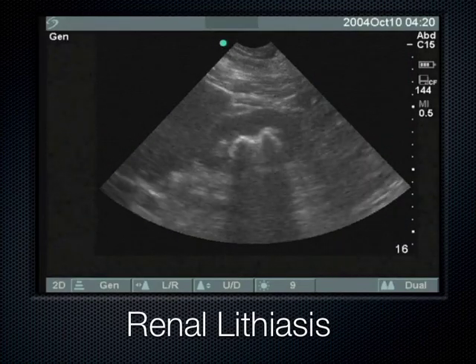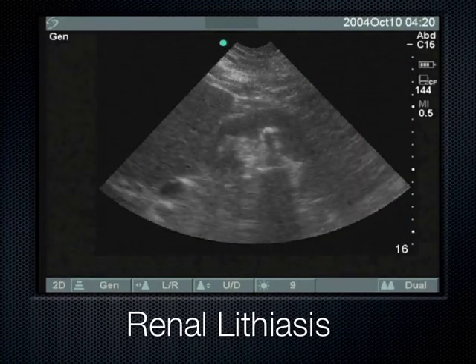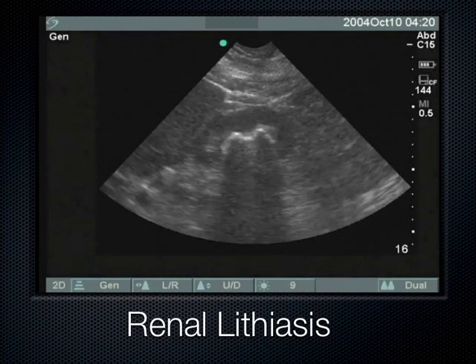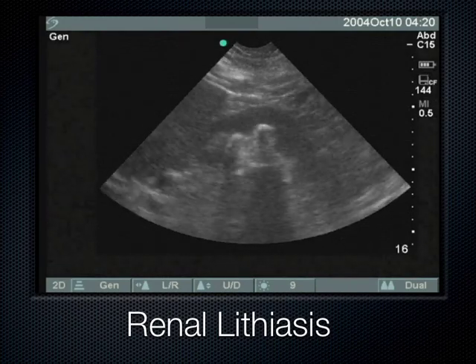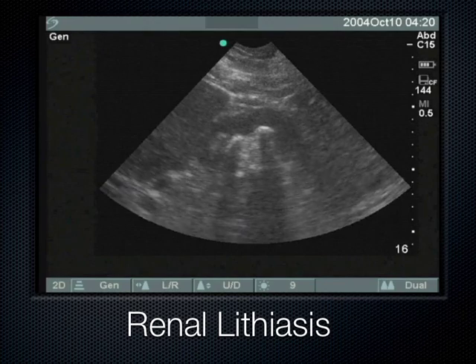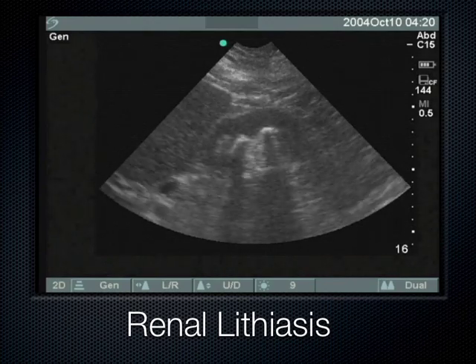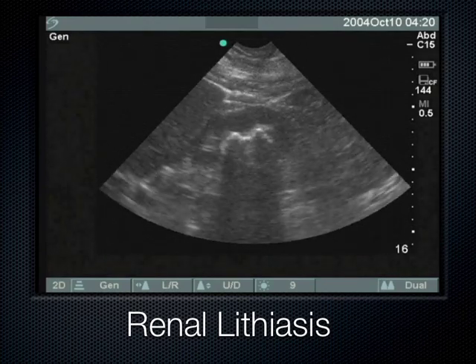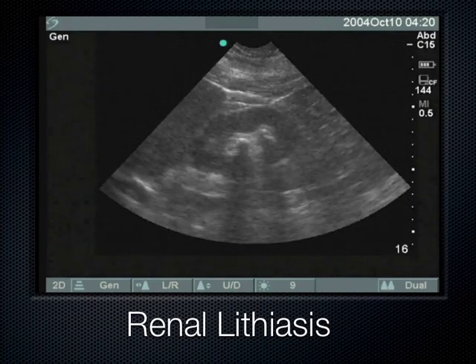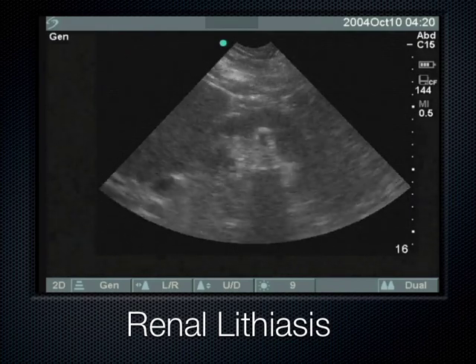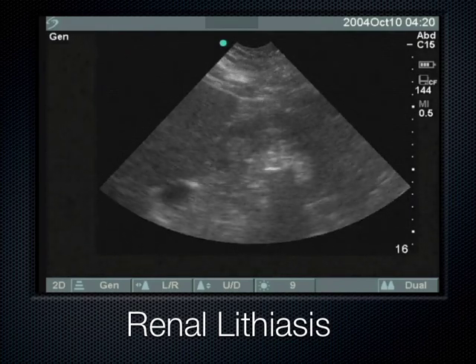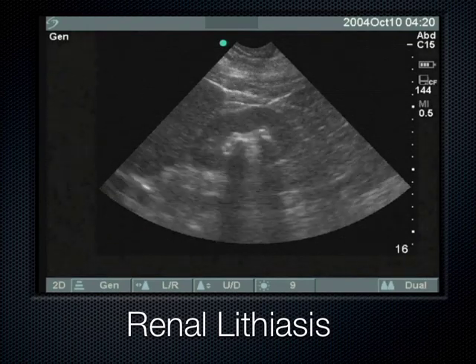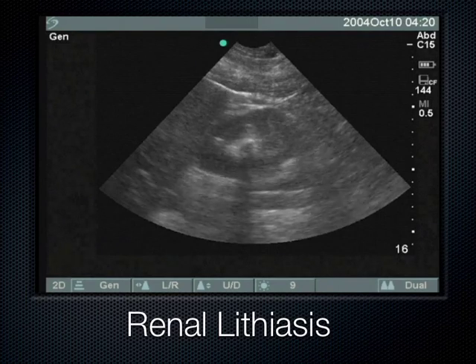When there's a stone — or in this case a couple of stones in the kidney — we know they're stones because they cast a shadow all the way to the bottom of the screen. Sometimes you'll see hyperechoic stuff that doesn't shadow. But when you get a shadow going all the way down, you can confirm that it's from a very dense calcified structure — in this case, renal lithiasis or kidney stones.